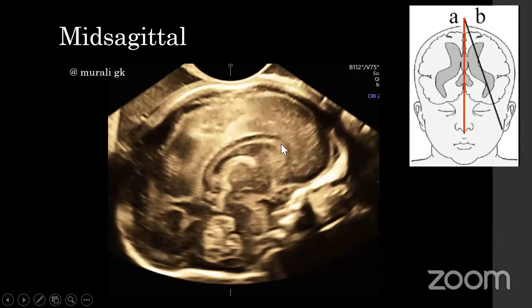Coming from anterior, you are seeing the corpus callosum, right? Just below the corpus callosum, you have a cystic structure, which is called the cavum septum pellucidum. We'll come back to that later. Now coming down, I'm seeing a C-shaped hyperechoic structure, which is a little broadened posteriorly and tapering anteriorly. This constitutes the tela choroidea, which forms the roof of the third ventricle. So the third ventricle is nothing but a slit-like structure between the two thalami. I'm cutting across it and I'm seeing part of the thalami here. So you find a slit-like structure in between the two thalami. Above that, you find the tela choroidea.